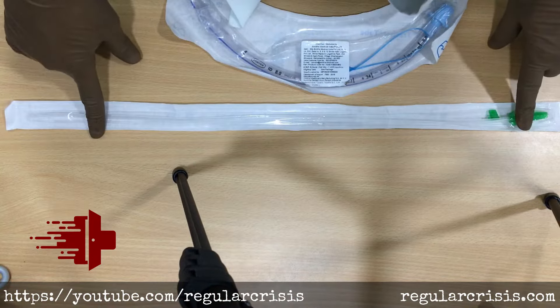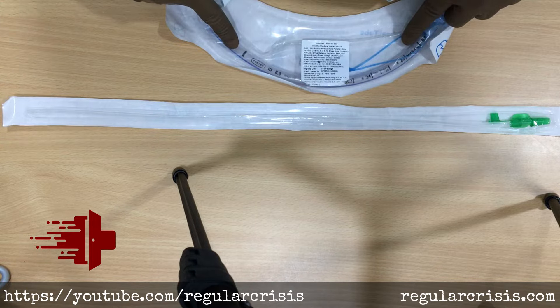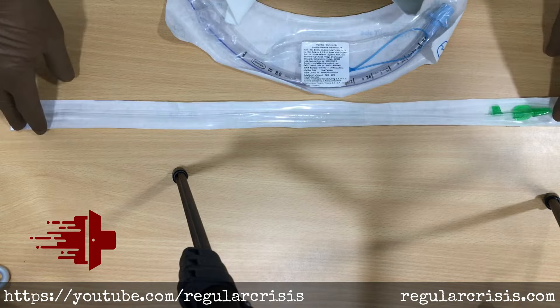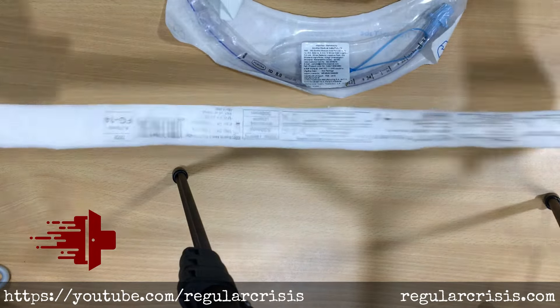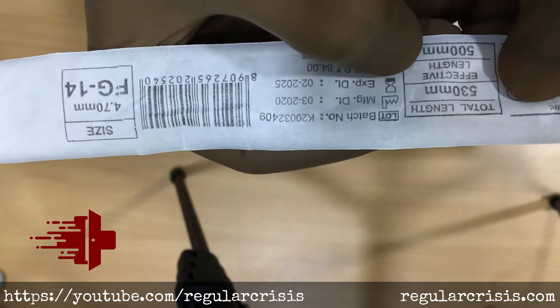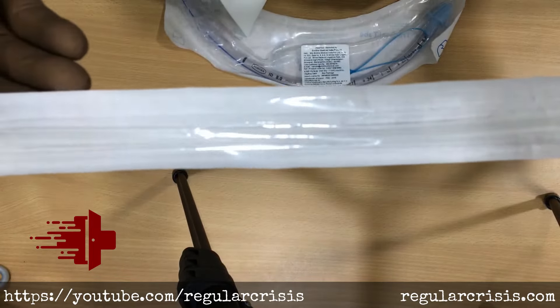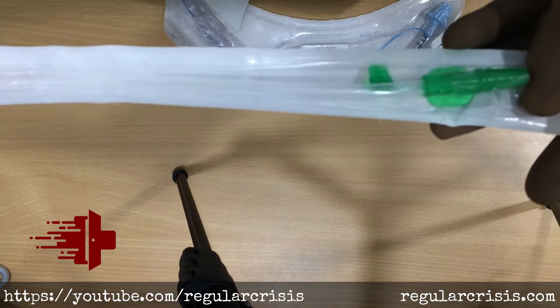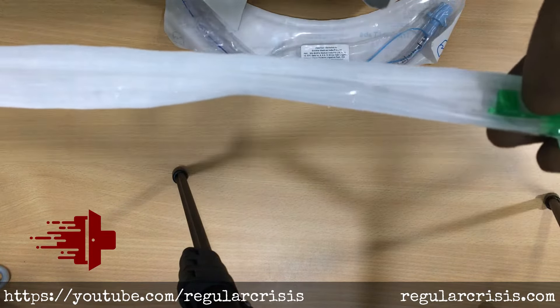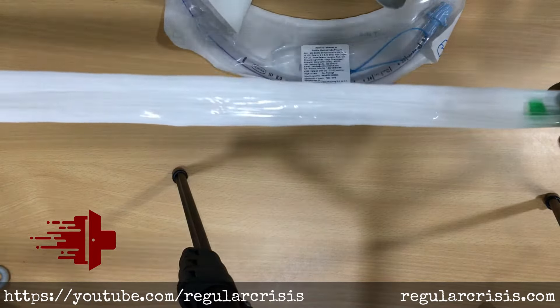Today we will understand how much length of suction catheter should be inserted inside the endotracheal tube while doing suction on a patient who is on a ventilator. This is your suction catheter. Its total length is 53 centimeters and the effective length is 50 centimeters — meaning the portion that can go inside the endotracheal tube is 50 centimeters.